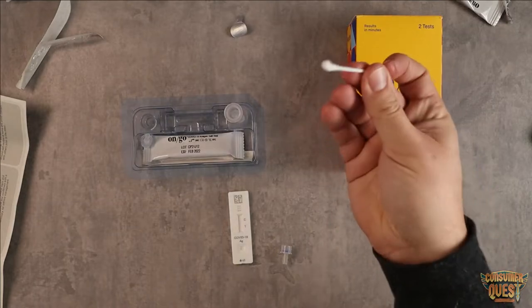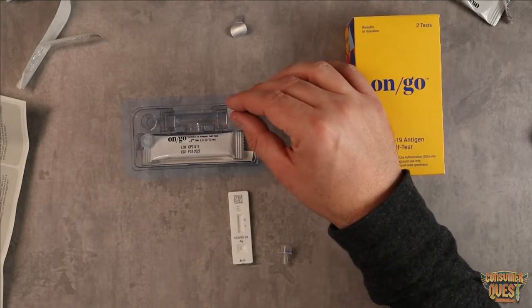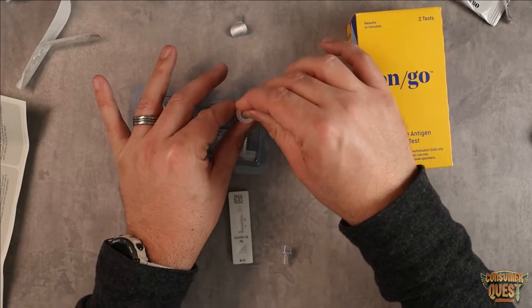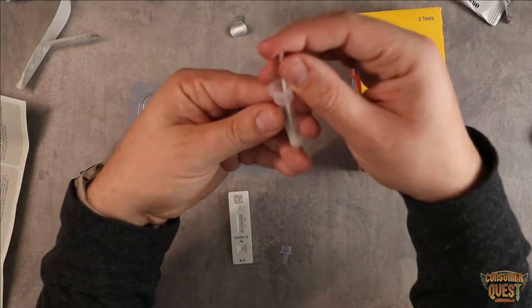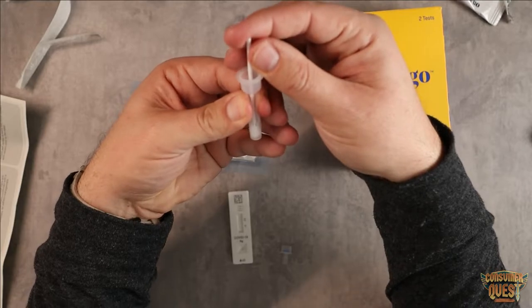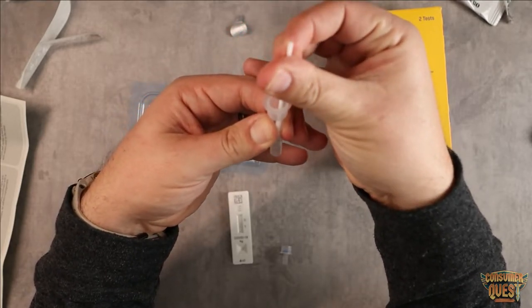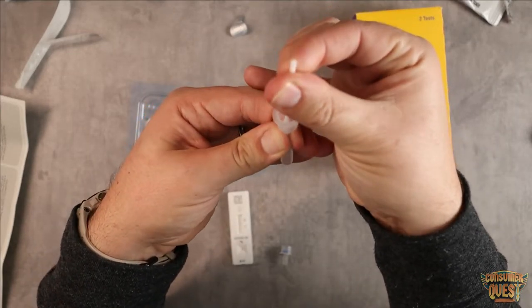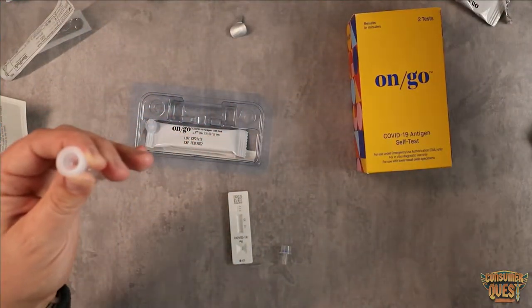Then we take the nose swab once it's done and put it down into the fluid. We're going to mix it around, swirling it around five or six times and let it soak in. Now, just like some of the other tests out there, the sides of this little container are soft. As we pull out the swab, we're going to use the sides to squeeze all the fluid out of the swab — as much fluid as we can — because we want to get as much of that nasal sample in there as possible.